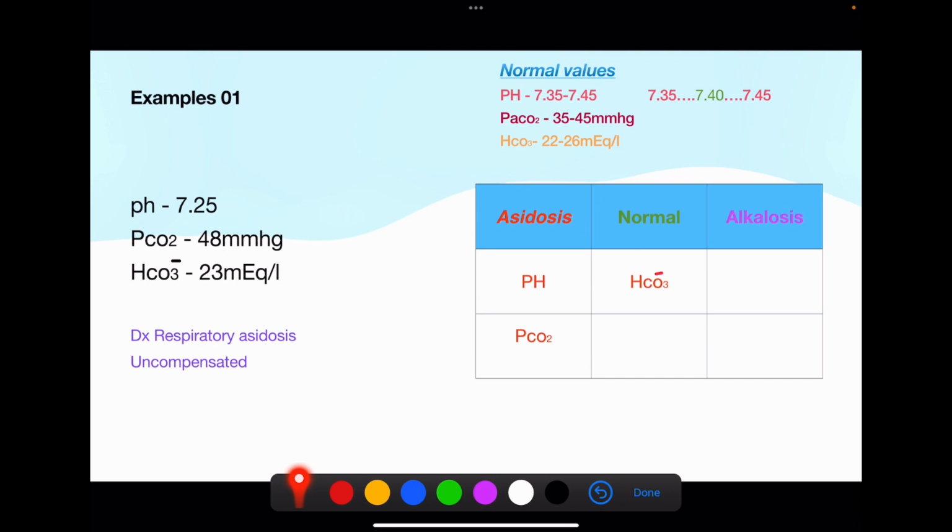We'll move on to some examples. I am going to discuss 7 examples here. Then you will be able to understand the principle behind this analysis and how easy it is to analyze if you go according to our steps.